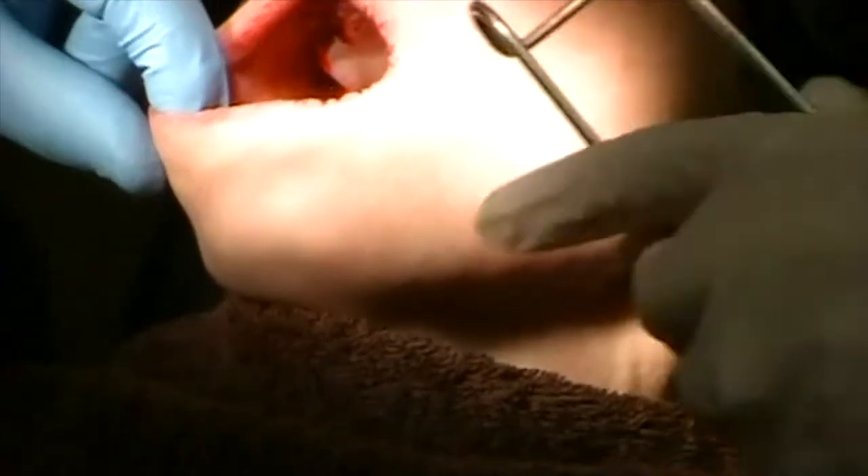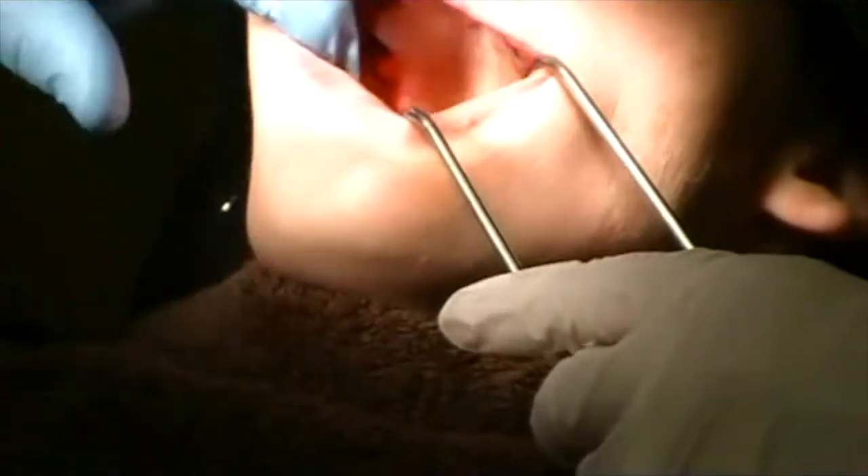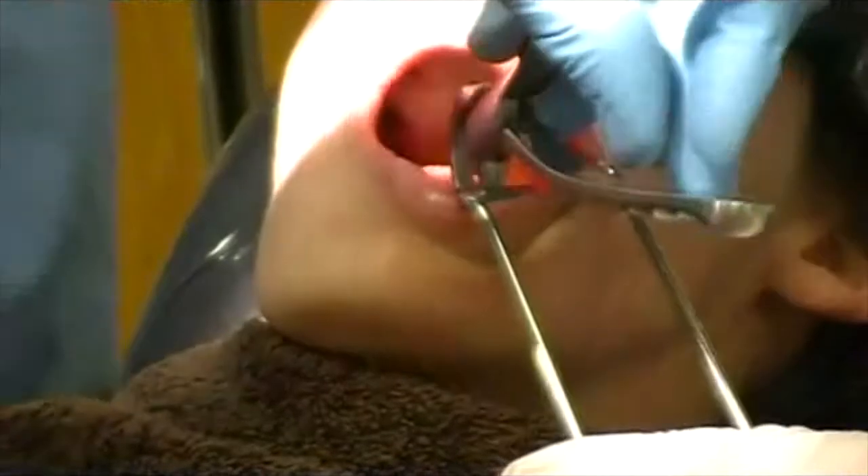On the other side of the other cuspid, we have some molars to do — four molar teeth. We're going to do those three molar teeth, and those are going to be a little bit different, so we'll stop and demonstrate. This one might be a little difficult for you to see.